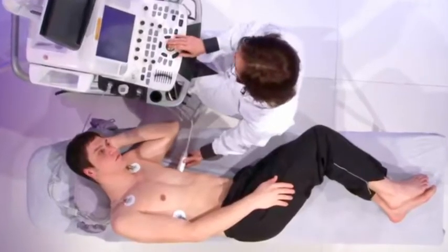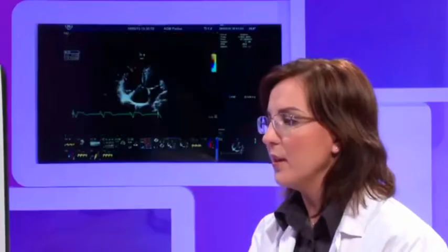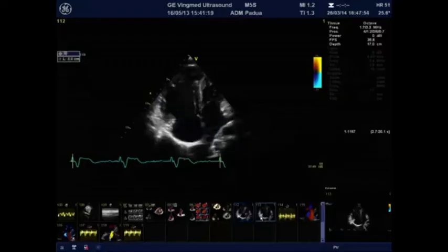switching again to 2D echocardiography, we can assess and concentrate the evaluation on the measurement of the annulus, because the annulus is a more sensitive sign of the severity of the tricuspid regurgitation when the mechanism is functional.